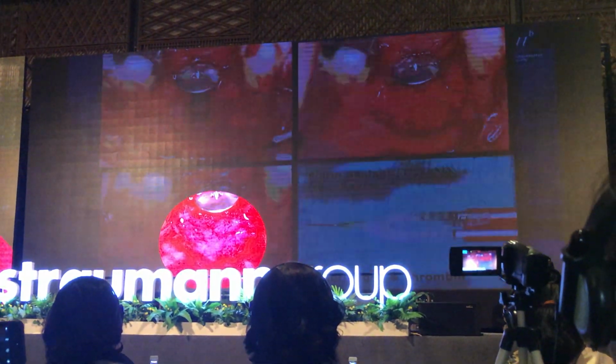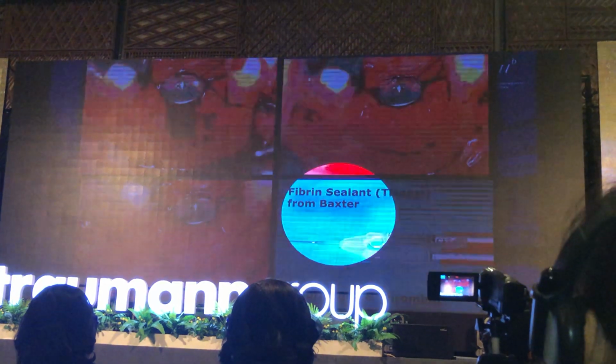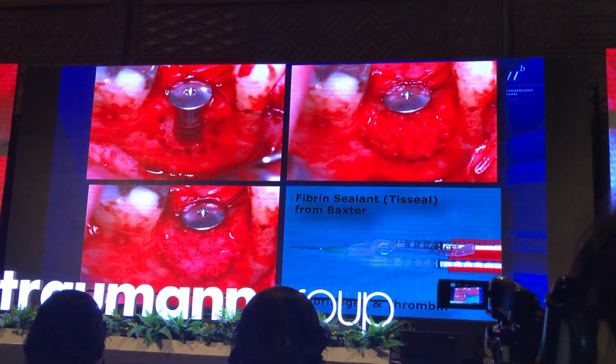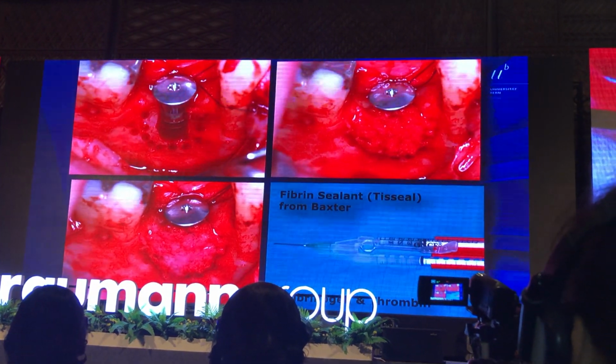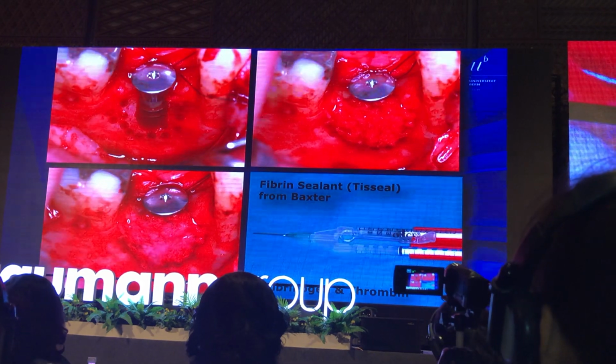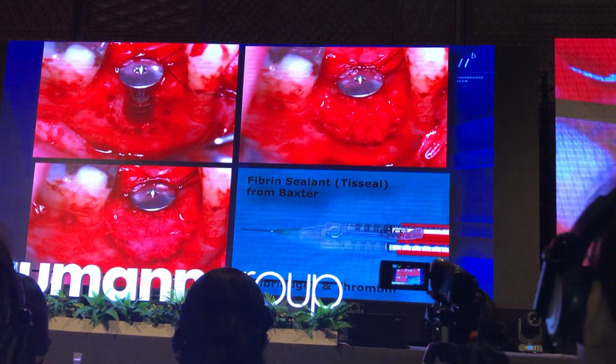This is the fibrin sealant. You see that here: fibrinogen and thrombin. It's called TISSEEL. It's a Baxter company from Massachusetts. It's a European product. They bought it in Austria. Austrian product, very nice.